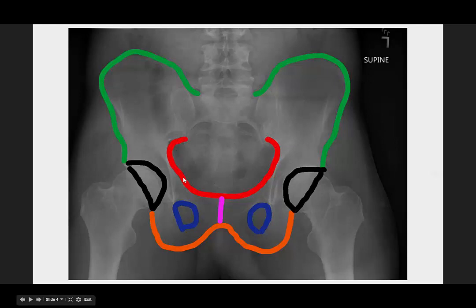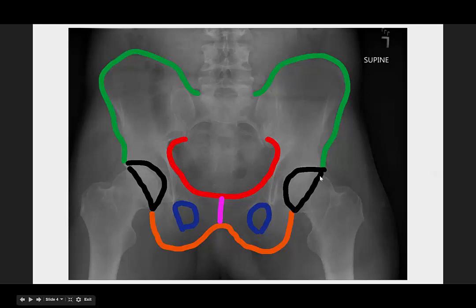I go all the way around, check the superior pubic rami, the pubic symphysis on my way down, and the ischioramus and inferior pubic rami — looking for any cortical irregularities. Then I check the two inner circles made up by the superior, inferior, and ischial rami. And these do not outline the femoral heads — this is checking the posterior wall of your acetabulum, where you get posterior femoral dislocations, and also your acetabular cup. That's how I read a pelvis film.